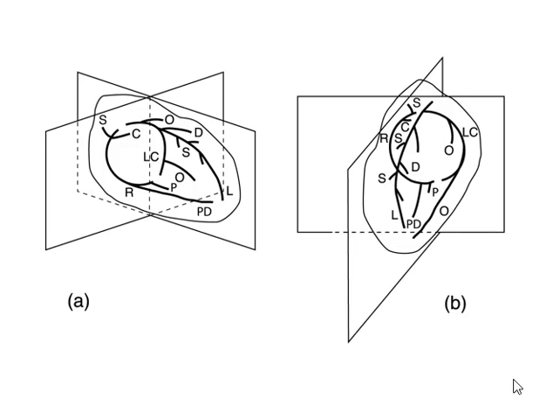This is a useful slide to keep in your mind. It shows how there are two planes of reference for coronary angiography, for cardiac angiography, two intersecting planes at right angles. And you can see here how the right coronary artery and the circumflex lie on that flat plane in that direction, and the LAD and the right coronary artery, the PDA, lie in that plane. That's viewing the heart in the RAO, in that profile view of the football that I like. And this is the LAO, showing again that plane for the right coronary artery and the circumflex, and the same plane for the LAD and the PDA.